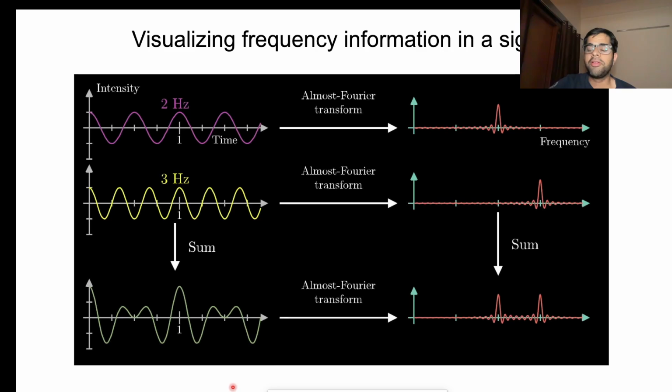So, coming to the first question, I've been using Fourier and frequency interchangeably because there are wavelet based techniques also, but even then, the base technique to split a signal into its frequency components is using Fourier transform. So everywhere, Fourier and frequency became interchangeable over time. But it's always better to say only frequency. So Fourier transform is a technique and frequency is a quantity. So that is the first one.